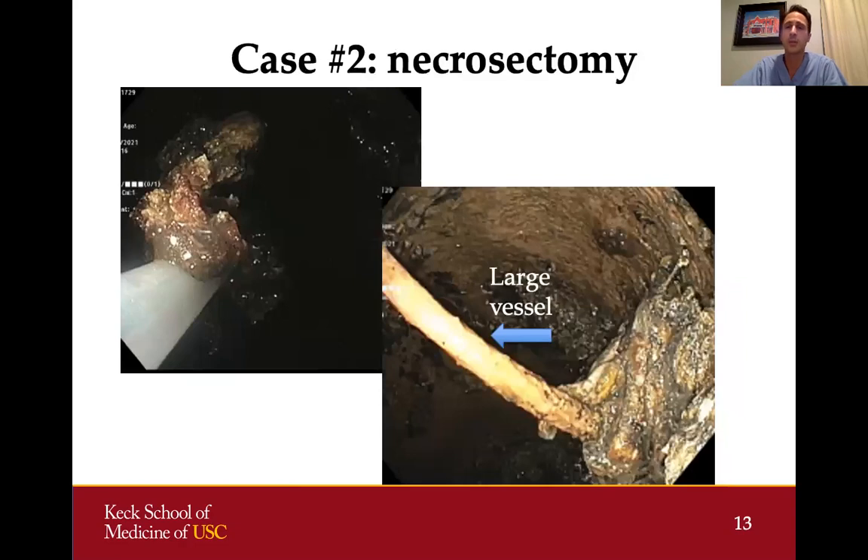We chose to perform an initial limited endoscopic necrosectomy, which is generally how I approach these cases. On the index procedure, we did a limited amount of necrosectomy using a snare to remove necrotic material. You have to be quite cautious during this procedure because large vessels can traverse these cysts. As shown in the picture with the blue arrow, a very large vessel crossing the cyst cavity could be very dangerous to disrupt if not recognized.